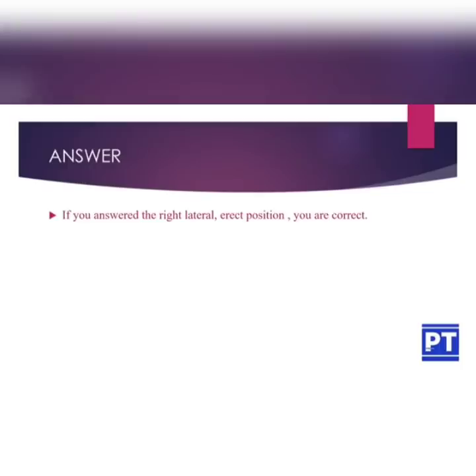So if your answer is right lateral erect position, then you are correct, since the patient's right side is in contact with the image receptor.